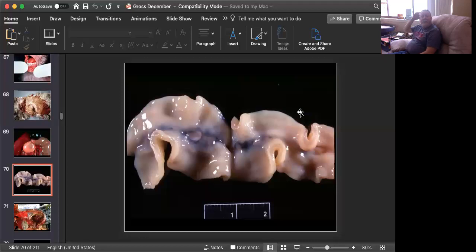And I remember way back in the dark ages when they taught us radiology in veterinary school, and all we had were dinosaurs to look at because that's all that roamed the earth when I was in veterinary school. But when you get plication, it's a very irritated gut. You want to think of a foreign body that causes this tremendous muscular contraction. And then we have this lesion right here. It is sort of a dark black that is fixed blood.